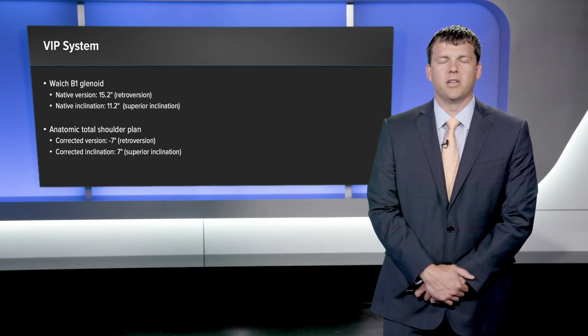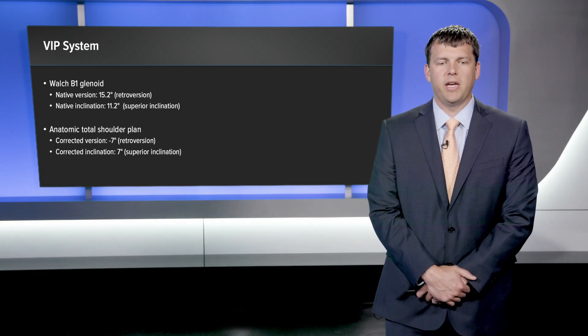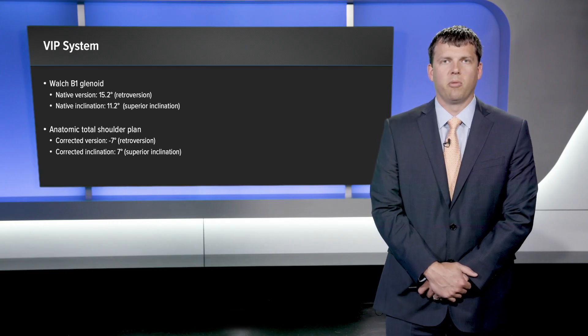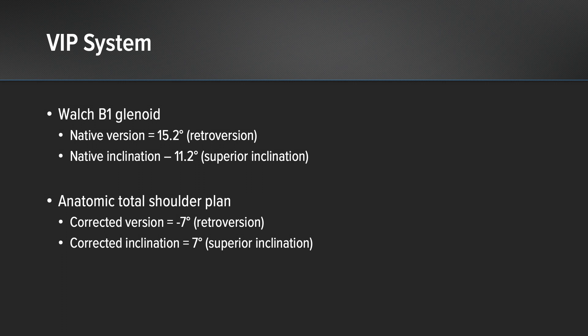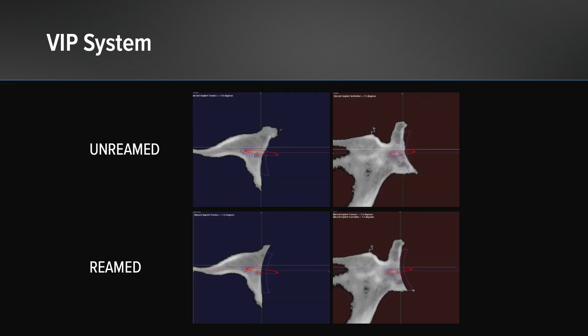So we're doing a mix of respecting the patient's deformity and also providing correction. This slide demonstrates both reamed and unreamed views of the patient's anatomy with our glenoid component — a large vault lock component — in position.